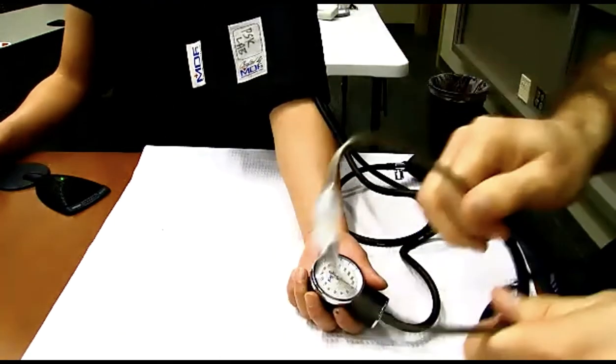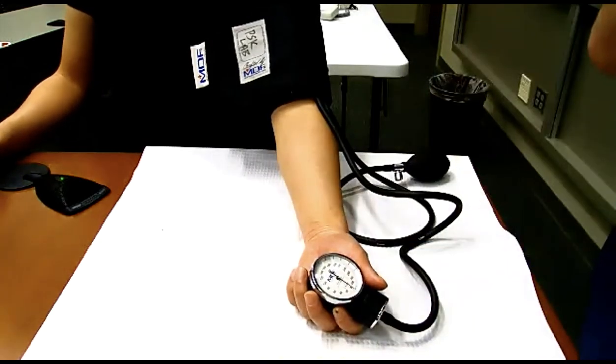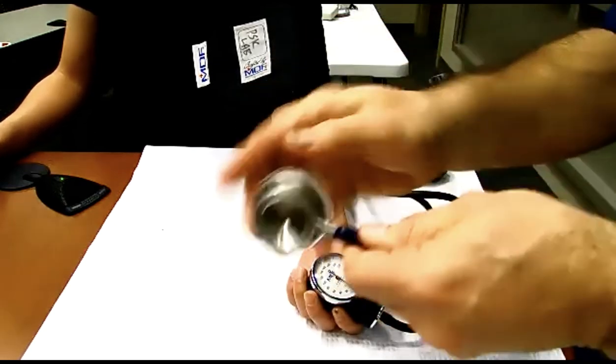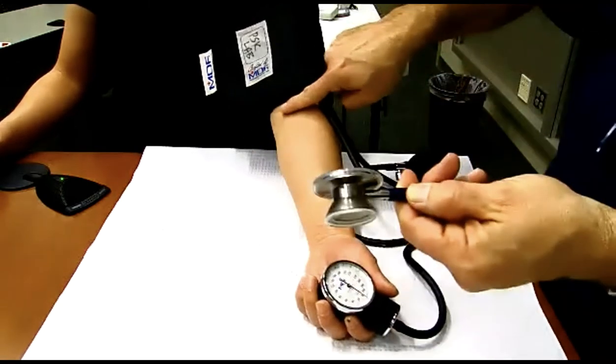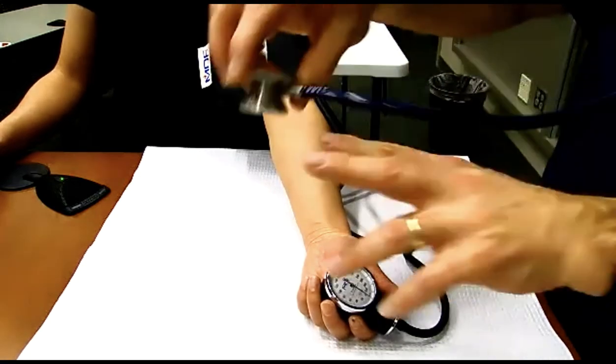So again, I'm now ready to put my stethoscope in. I'm going to look at the angle and put that in the right way. I'm going to look here and make sure my dot is lined up. In this case, if I want to do the bell, my dot is lined up right there with my bell. So I'm good to go, right? Now, this is where we said we're on the inside, the pinky side, above the bend in the arm, just barely.